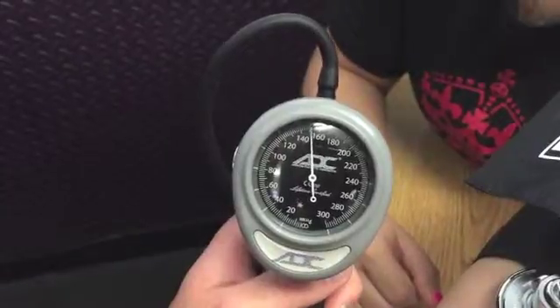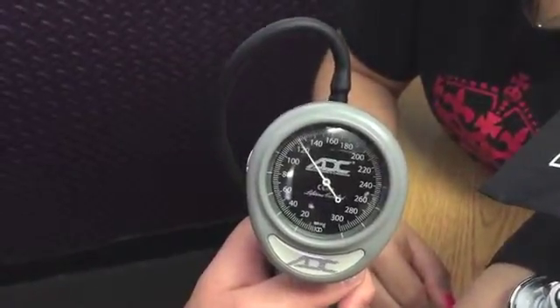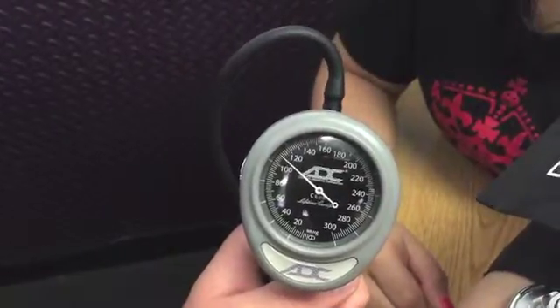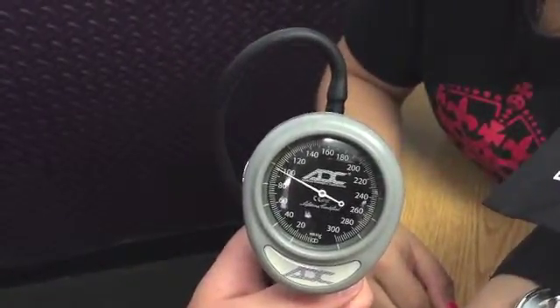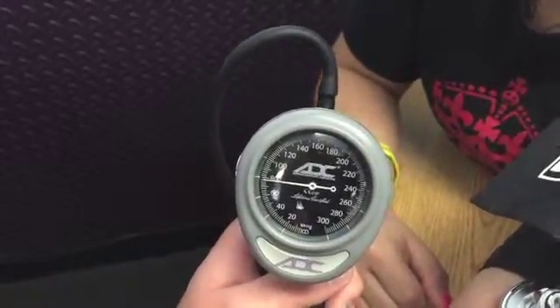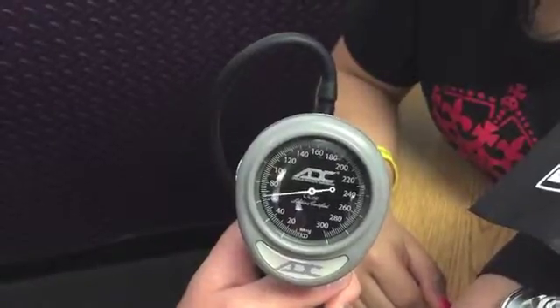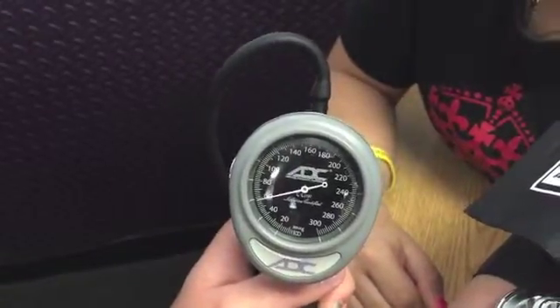The very first sound you hear will be the systolic blood pressure, which is also known as phase 1. You'll continue to hear sounds that will fade out slowly, and the very last sound you hear is considered your diastolic blood pressure, which is also known as phase 5. With these two numbers, you'll have your total blood pressure.